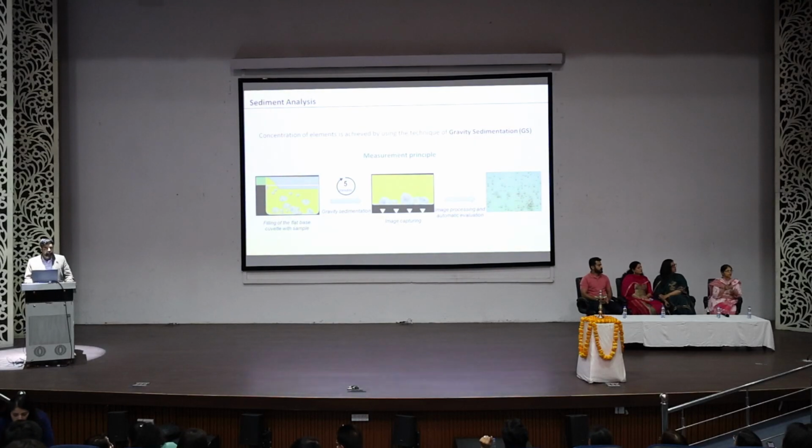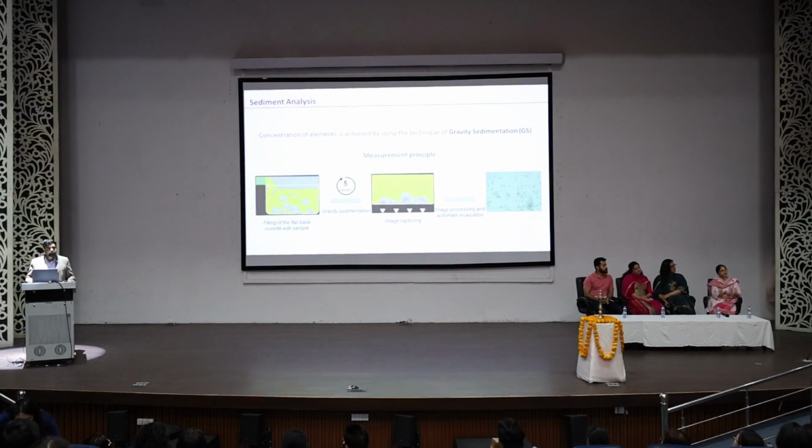This is how the instrument works. The sample is taken. There is no centrifugation and no mixing of the sample outside the instrument. You just keep the sample, and it will be homogenized within the instrument. The probe will touch the sample, homogenize it and transfer it to the cuvette. After filling the cuvette, gravitational force immediately acts upon the sample.